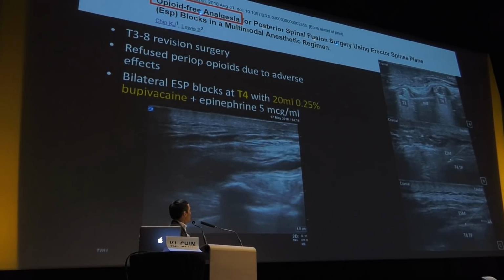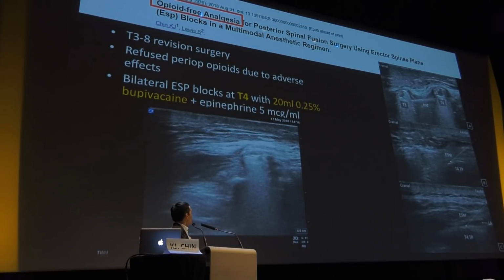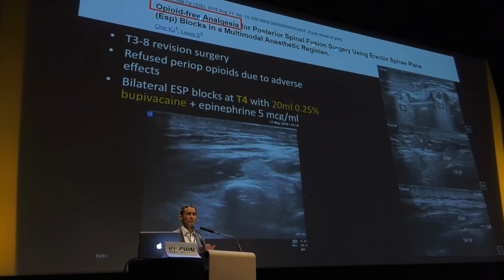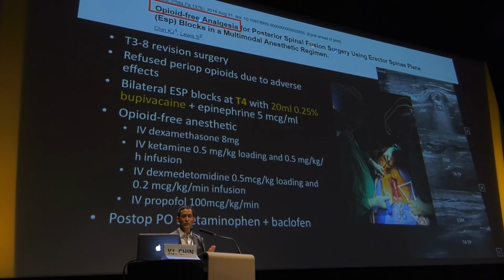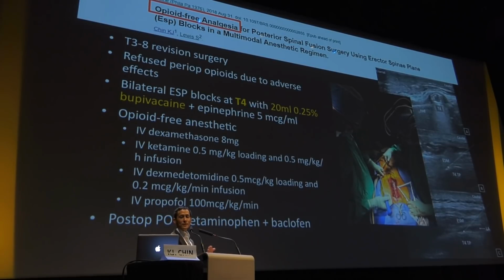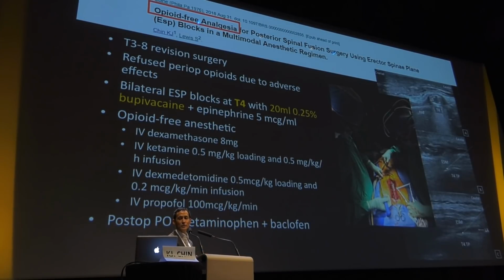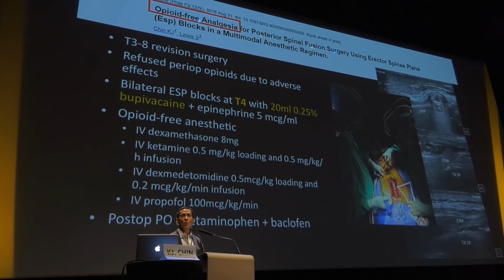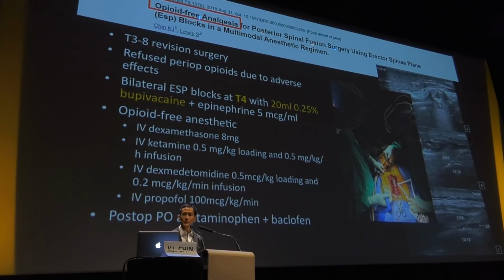And so you can see here we're lifting again her erector spinae muscle up off with the needle, and we are lateral to where those pedicle screws are. So as long as you're sterile and your surgeon's not going to be too worried about you contaminating the field, this is a block that can easily be done. So again, she had an opioid-free anesthetic, and I think these components are actually very, very important to use. Dexamethasone to use, ketamine to use, dexmedetomidine, and potentially those things too may potentiate and prolong the effect of your blockade, together with a TIVA anesthetic. And this patient did very, very well, only needing acetaminophen and some baclofen for back spasms during her entire stay in hospital.